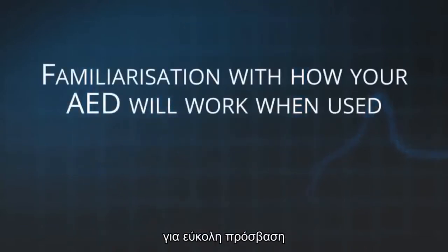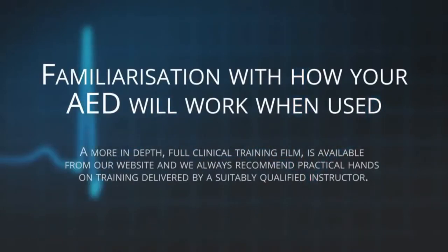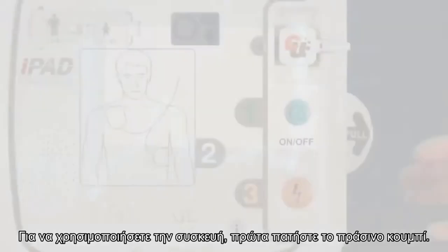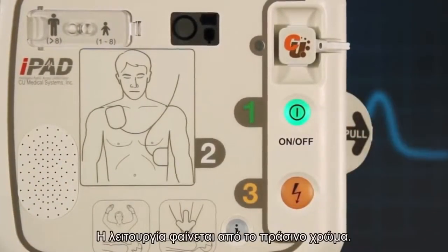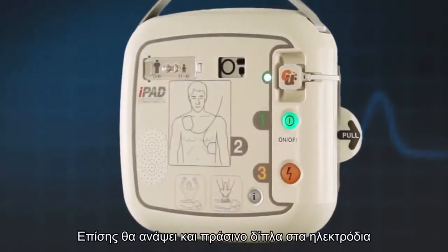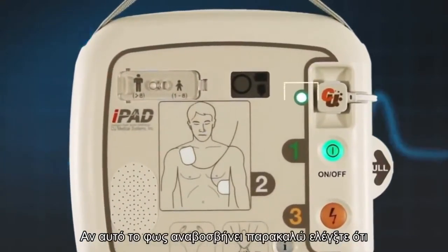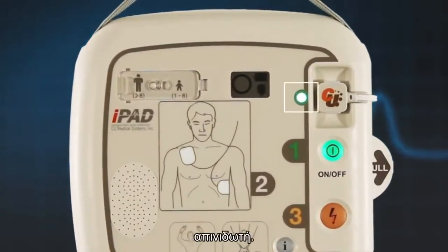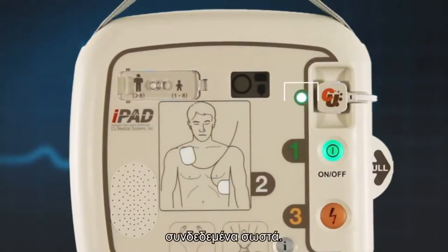This section will familiarise you with how the iPad SP1 works when used. To use the AED, first press the green on button. A green light next to the pads connector will illuminate to show if the electrode pads are properly connected. If that light is flashing, please check that the pads are correctly connected to the unit. If the light is constantly lit, the pad connection is good.